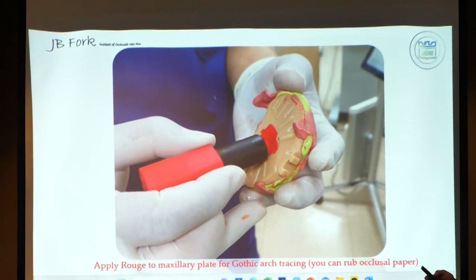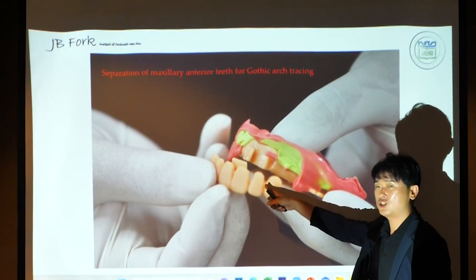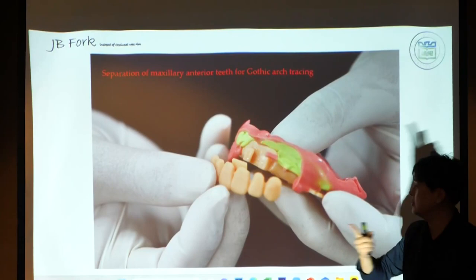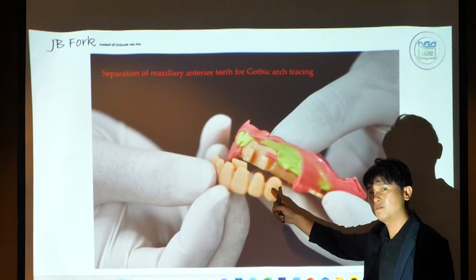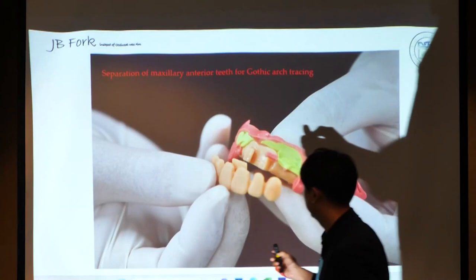This is a key point. When you decide to draw the Gothic arch tracing, you have to detach these six anterior teeth. Why? When the patient protrudes, the lower teeth can touch this anterior tooth. These teeth can disturb the movement, okay? So after removing the anterior teeth, then draw the Gothic arch tracing.